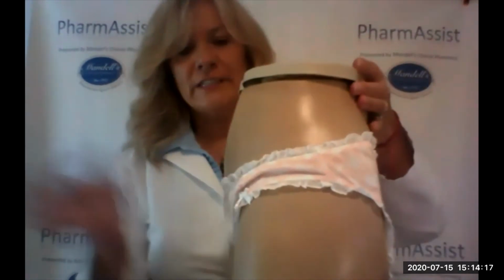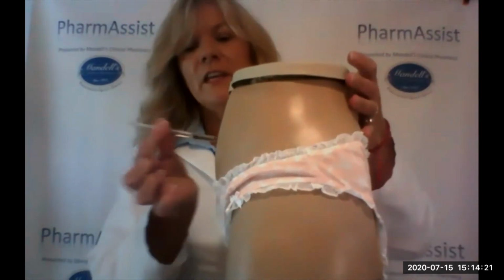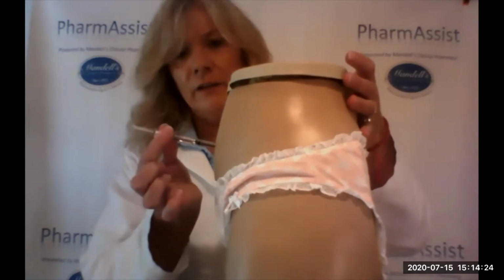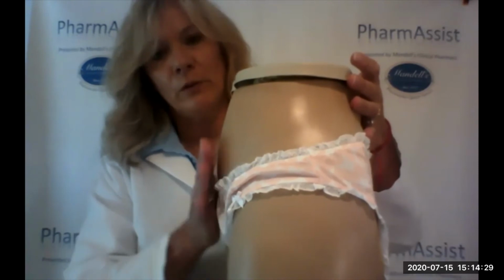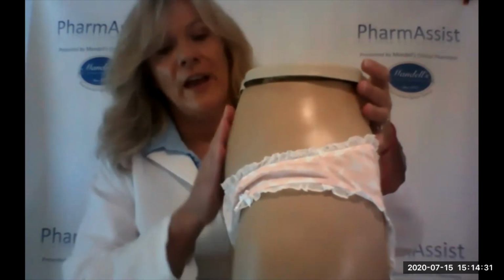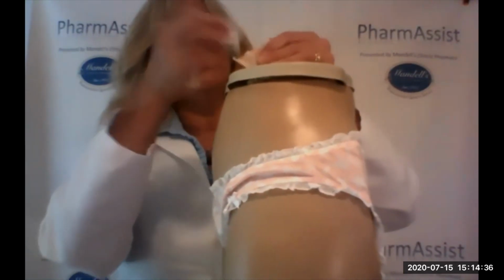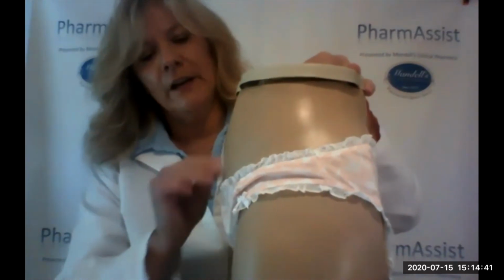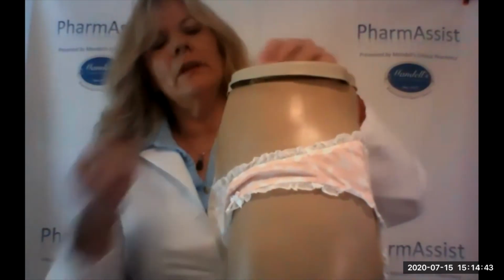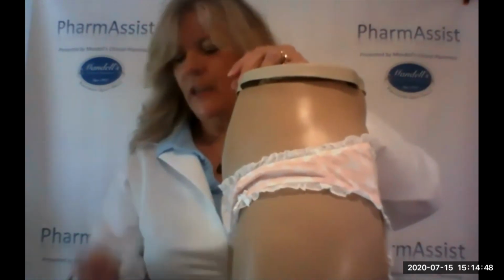If I were self-injecting and I was standing, and my body as the mannequin would be here, I just want you to see that the needle would go in at a 90-degree angle. The other part of this type of shot is that you pinch the skin just a little bit when you administer it, because you want to make sure that you're getting into the fatty tissue. First thing we do to that area is clean it with alcohol. Just get a good little clean there. Next step, we uncap the needle. Just be careful. Put that cap down.